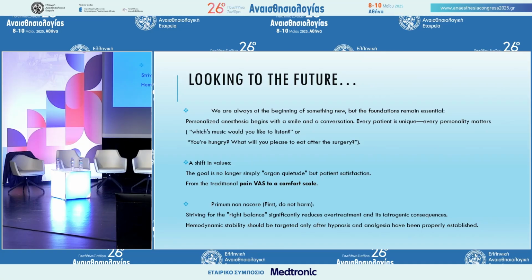What is, for you, a satisfaction scale for an anesthesiologist? Until now, I would go to the recovery room and ask my patient, do you have pain? And he tells me, on the 0 to 10 scale, 0, and I was satisfied. We were reaching for the holy 0. But 0 pain doesn't mean that my patient is comfortable at all. And now we are changing this view. We reach for the right measure. We reach for doing the right thing for the patient.